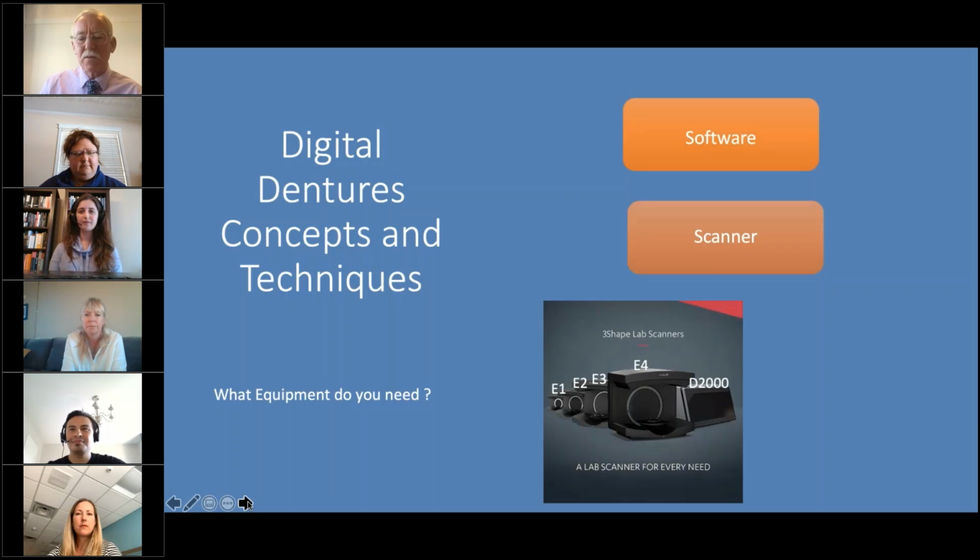One of the reasons why we've got an E2 and E3 as well is we do actually have multiple outer clinics. So I'm experimenting around those clinics to scan impressions and scan retries and things like that, and about the accuracy. For our outer clinics, I want a definitive answer whether an E2 is accurate enough, or do you need to go to the E3, or is it better to give a clinician a Trios scan?